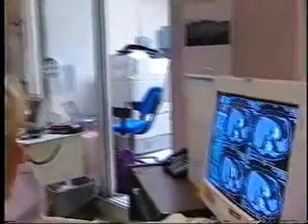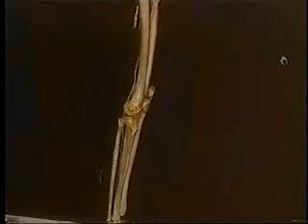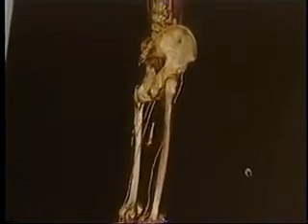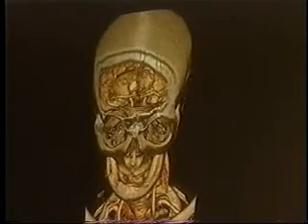Radiologists use scanning equipment to take pictures of a trouble spot. That section is scanned in slices. With three-dimensional technology, those image slices are then molded together to form a complete picture. Whether it's the abdomen, the liver, the aorta, the chest, the lungs, we can recreate the anatomy as if you were looking actually at the patient.